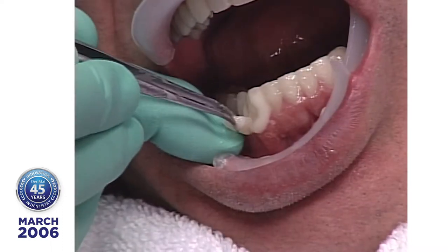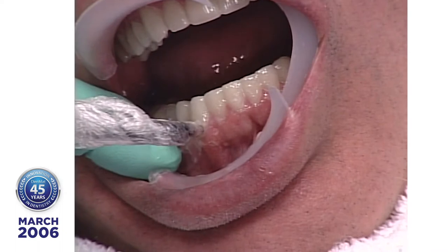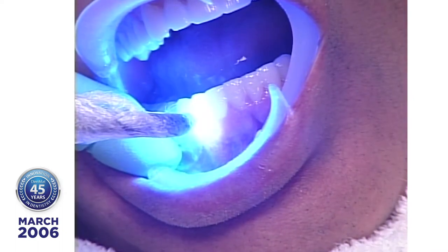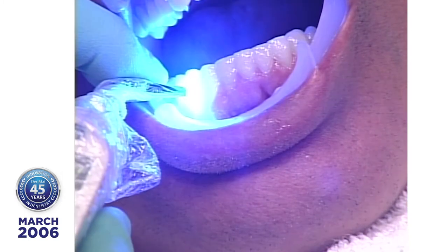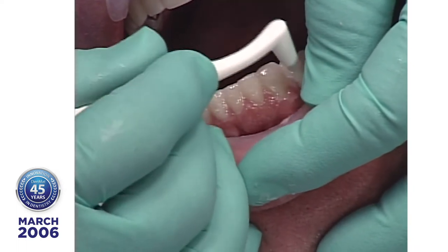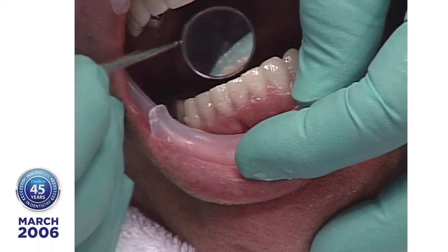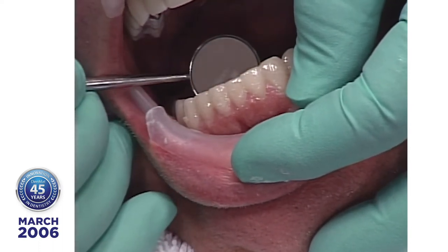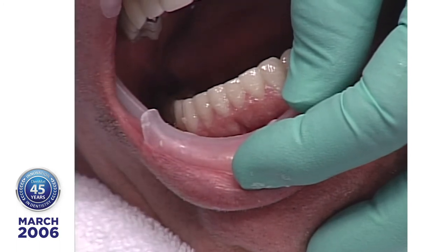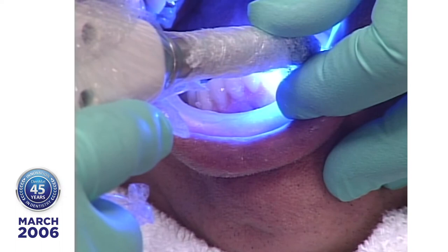Okay. Close your eyes. Now we have these tacked in place, and we'll give everybody a look at the lingual side. This is when I really like the paint on dental dam, is on the lingual of these lowers. What I'm looking for on the lingual side is to make sure that I have enough ultrabond between the porcelain and the tooth so they'll become one solid fused mass. Now I'm going to apply 5 seconds with the 9 millimeter tip on each tooth.